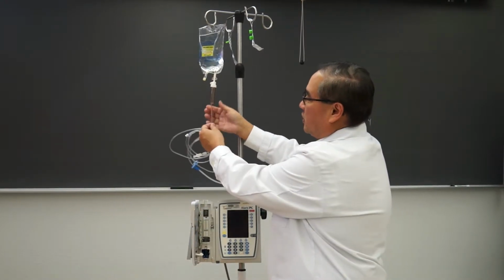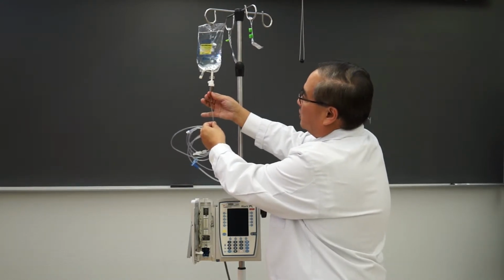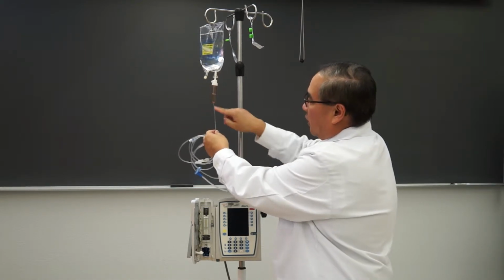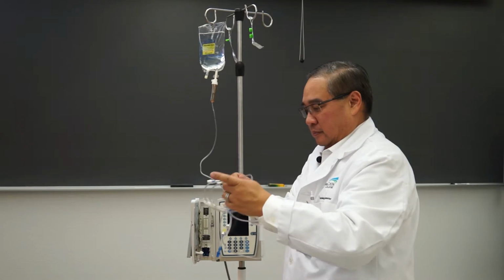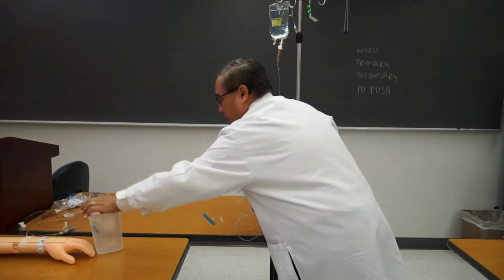Give it a couple squeezes because you want the fluid to be about the one-third to half mark, somewhere in that category. So I'm squeezing it. You see the fluid coming out there? Okay, that's about halfway. Now all this is air in the line, which we don't want to run into the patient. So what I'm going to do here is I am going to what we call prime the tubing. I'm going to grab this, I'm going to pretend it's a trash can.